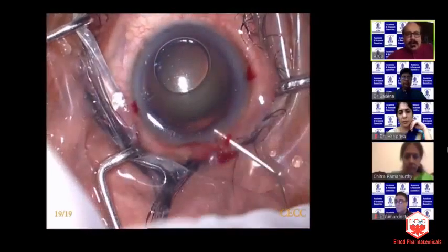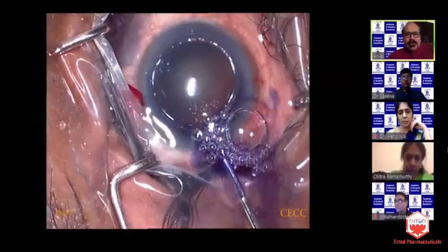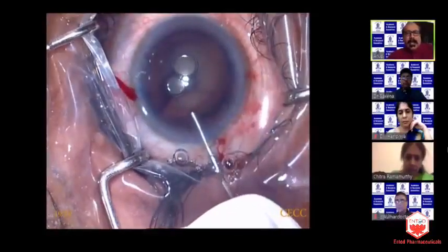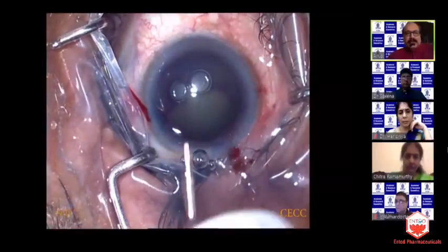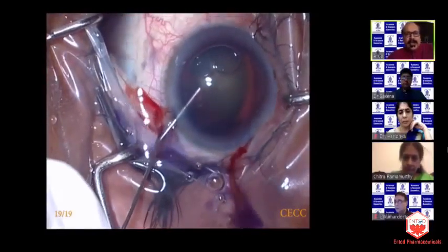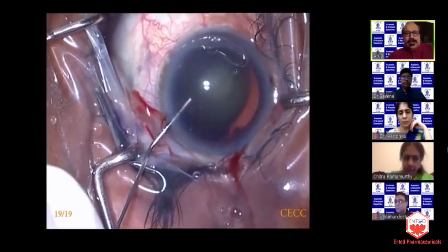becomes uneventful. And in the meantime, I thought that I will continue with the rest of the steps, like staining the anterior capsule, making the capsular rhexis, as long as I'm able to avoid complications, as long as I'm able to go ahead with the routine steps. And I'm just biding my time for the intraocular pressure to come down, for the anterior chamber to deepen.